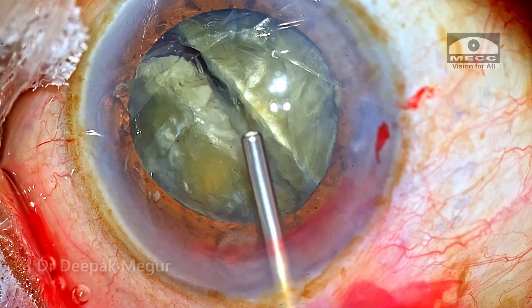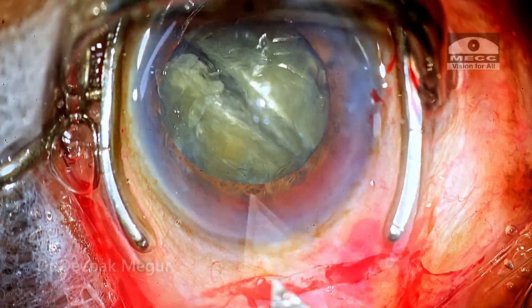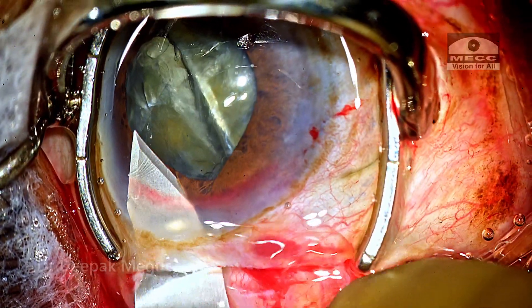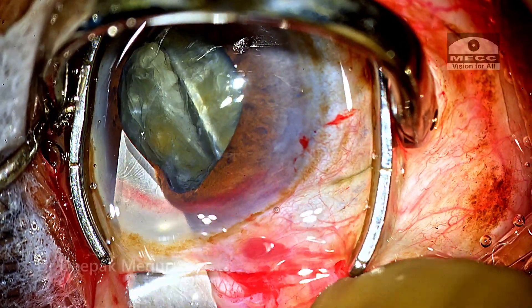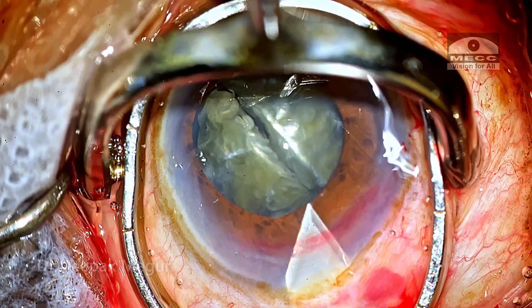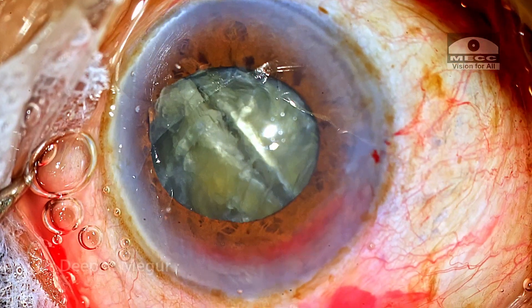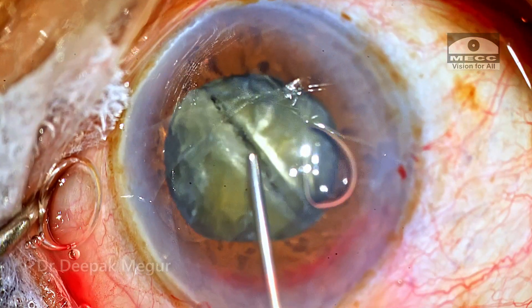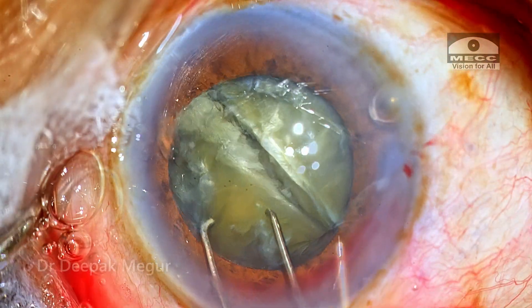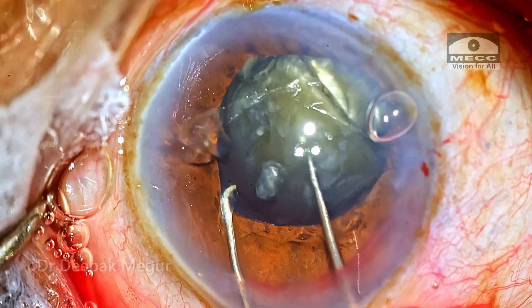Time to enlarge the incision. The globe is being stabilized and the incision is enlarged using the sharp keratome to about 6.5 mm. Time to remove each of these hemi nuclei out of the bag first and then out of the eye. Under the cover of cohesive OVD, using two Sinski hooks, the first hemi nucleus is being prolapsed out.